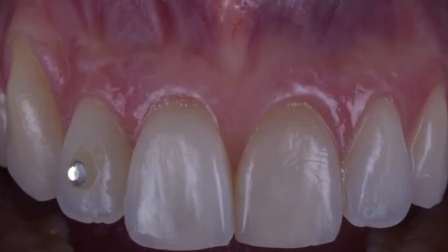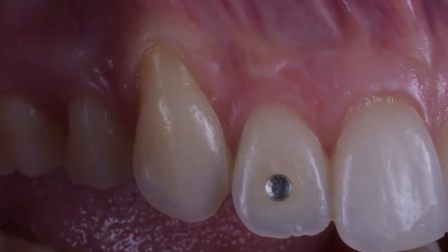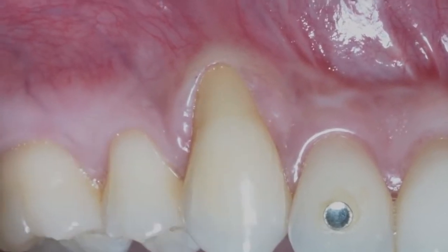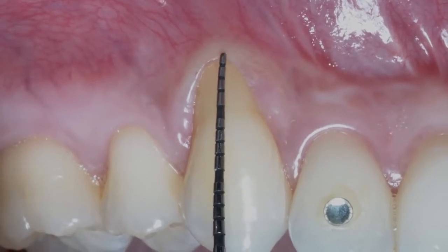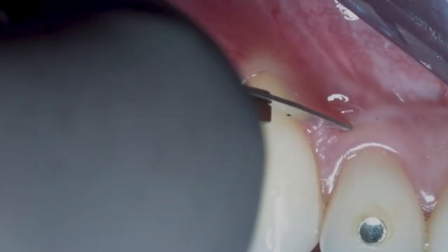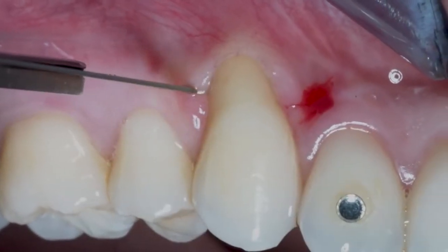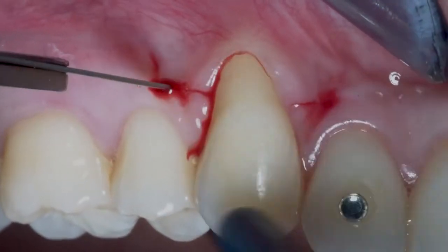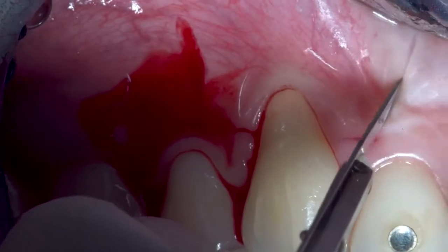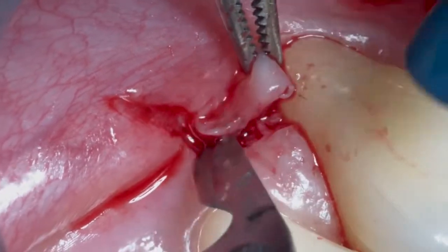Let's focus on some particular aspects you need to know to treat a case like this. This is a very difficult and tough case because you have no keratinized tissue at all. The first concept is that the tissues are very weak, so the horizontal incisions you see are made in alveolar mucosa — you are not performing incisions in keratinized tissue as you are used to — and so you need to be very careful in the procedures.